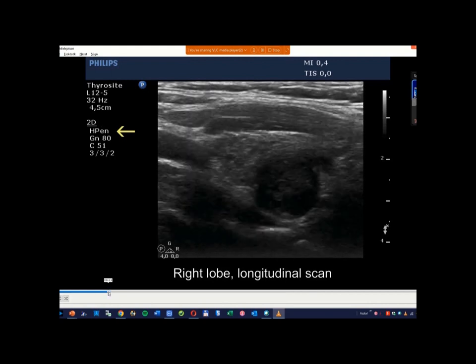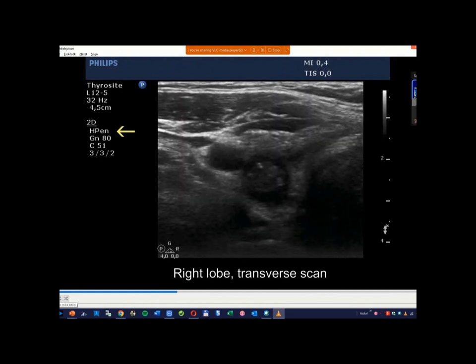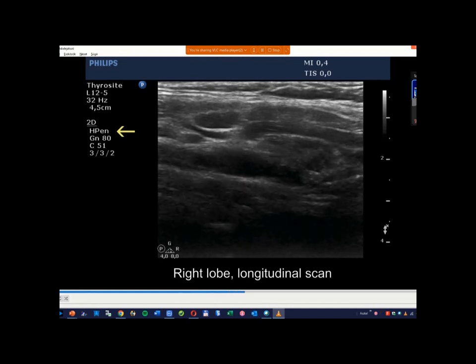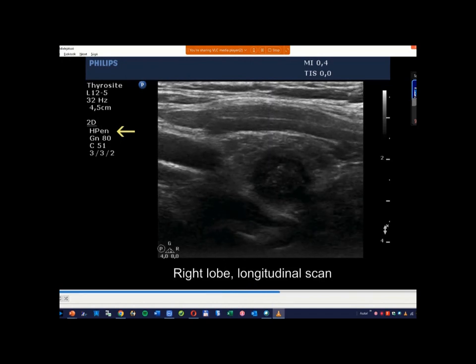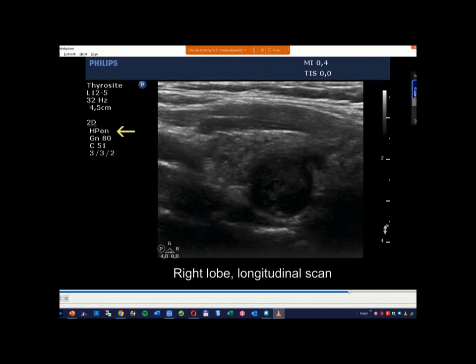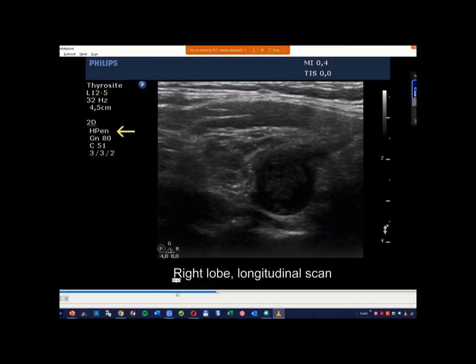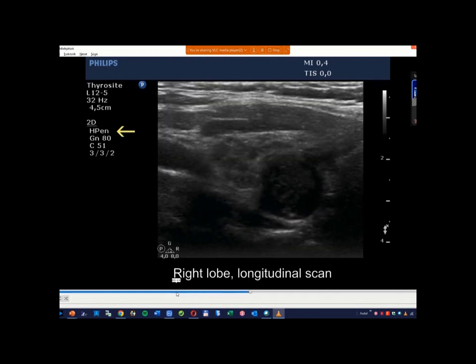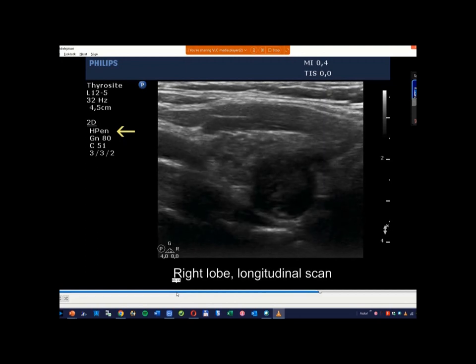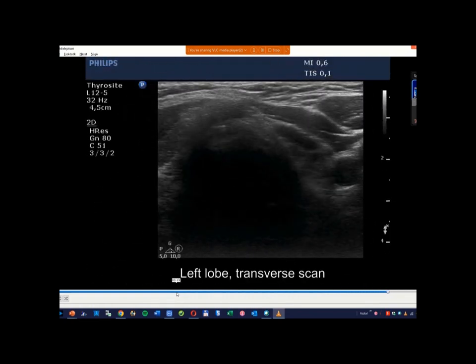So we had three cases, or I had three cases. The first proved that in the event of non-diagnostic cytology, the ultrasound pattern can decide that the patient has to be sent to surgery. The second case proved that we have limitations. We are not gods. We can never be 100% sure about a lesion which has a very suspicious presentation. And here is a third case, which in contrast with the previous one, proves that it has capacity. Decision made on ultrasound presentation and clinical presentation despite a negative cytology. So we have many, many questions and much fewer answers. But this is our task, to deal with this situation.